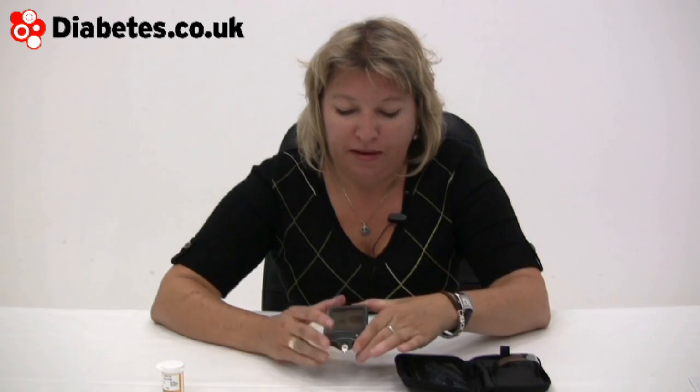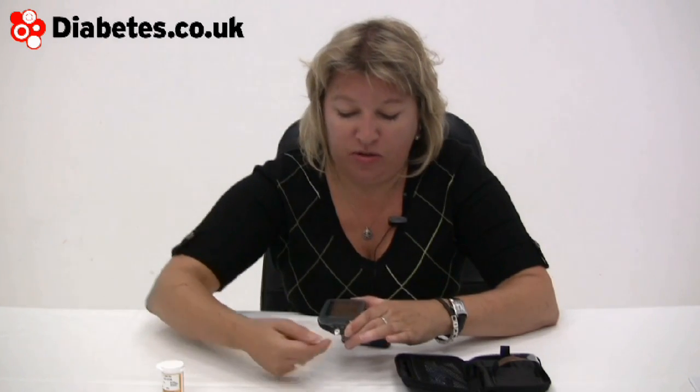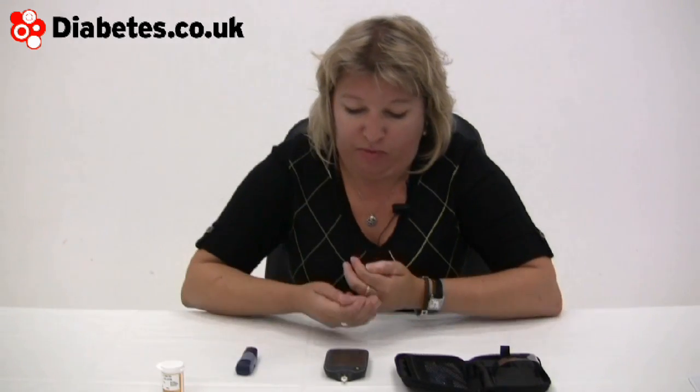A great advance with this meter is its huge screen. It's taken a lot of mobile phone technology, the way gadgets in our lives are moving and changing. It actually shows you how to apply the blood — in this case it's not on the bottom, it's on the side. I'll quickly do that and then show you some of the other graphics available.